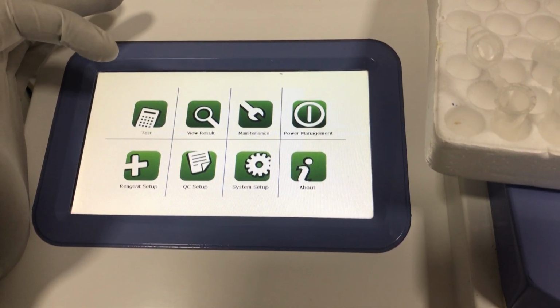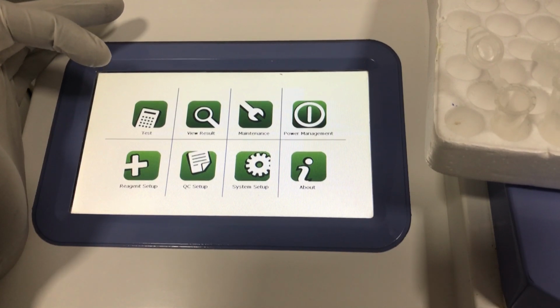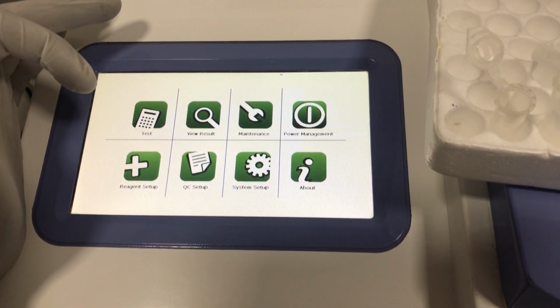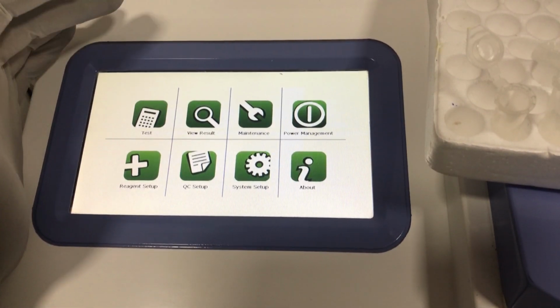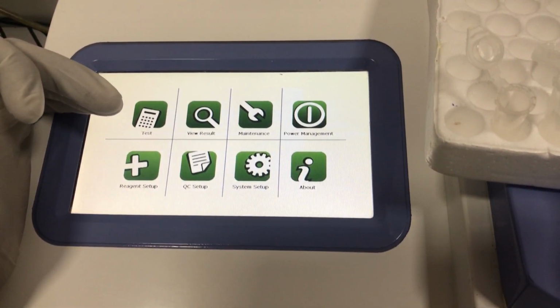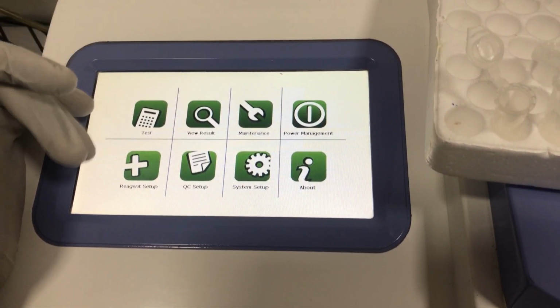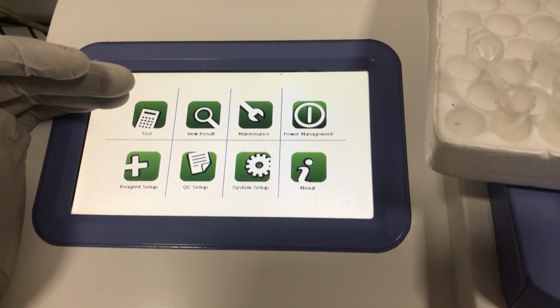So when you have any disease of the liver and then the biliary tract, one of the enzymes that we're going to measure to help us is GGT. And then one important thing about GGT is that it has a very high negative predictive value, and so it's used to rule out any disease of the liver or the biliary tract. And mind you, it's used in association with other enzymes like ALT and then AST to do a differential diagnosis for any liver disease.